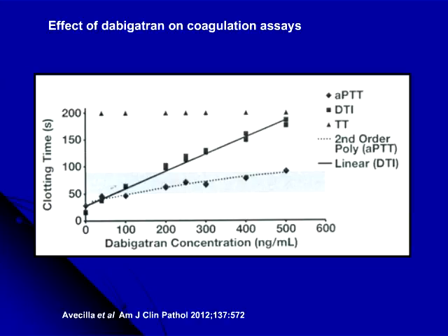Now, in terms of quantifying a thrombin inhibitor, it's evident that the thrombin time is clearly too sensitive, and I described the patient who was still waiting for surgery 4 days after stopping Dabigatran with normal renal function. It was interesting in that patient that when I inquired, the laboratory was using an APTT reagent which was quite sensitive to Dabigatran, and in fact the APTT had normalised within 36 hours of stopping the Dabigatran. And so my advice was to take the patient to theatre, which happened, and the surgery was performed without any bleeding.